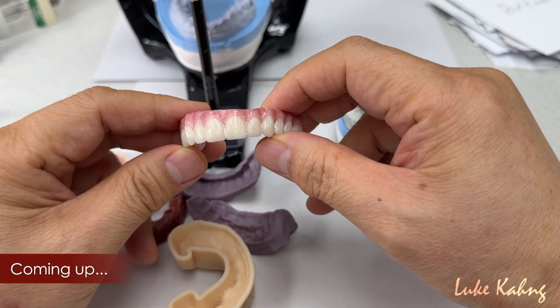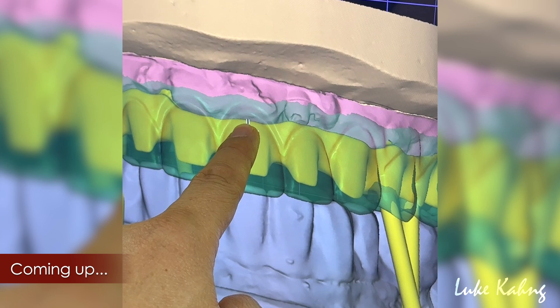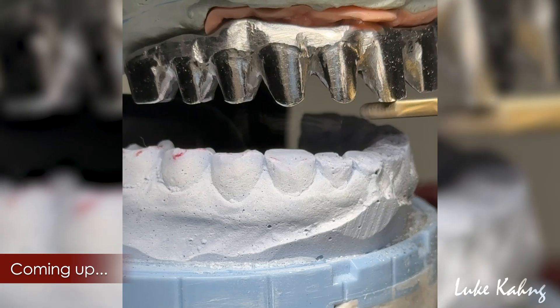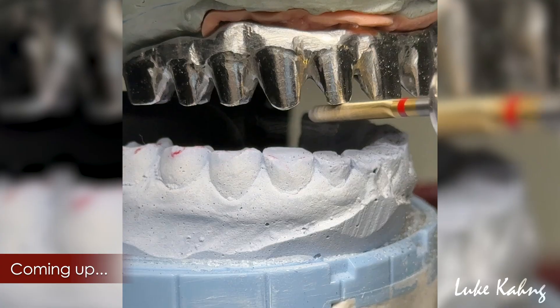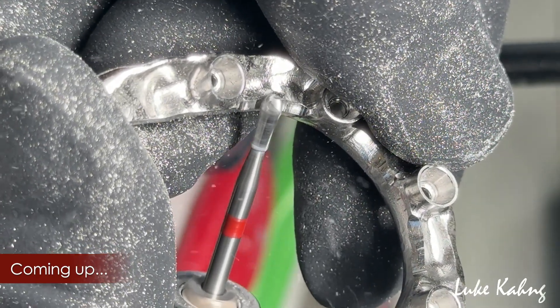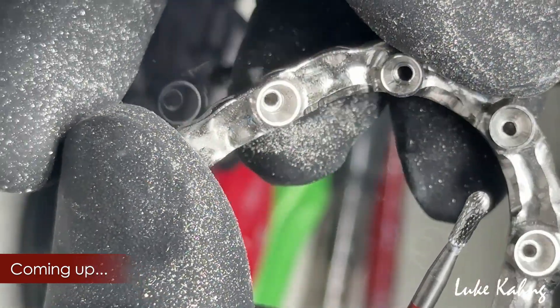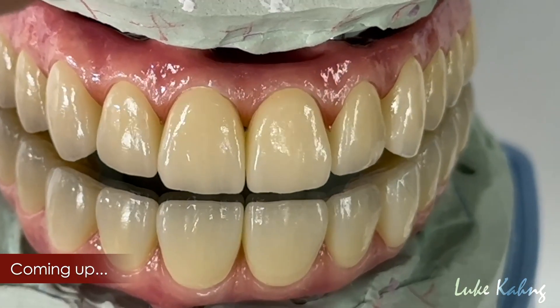The other lab fabricated the zirconia restoration, which is monolithic. We have to improve the tissue area's gum aesthetics. I have to narrow down a little bit better tissue contour, which is zigzagging. And also, it's really thick from the facial and lingual, and this is a problem underneath. The finish line is right on top of the line.